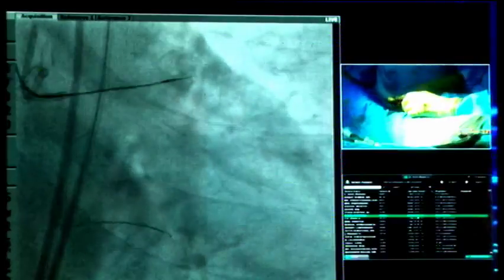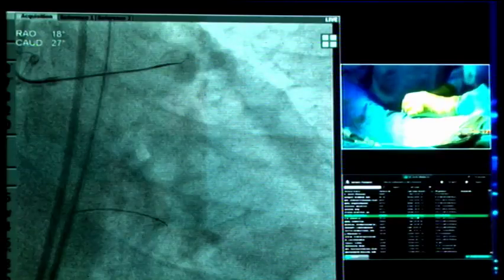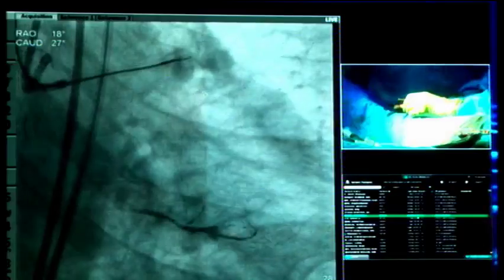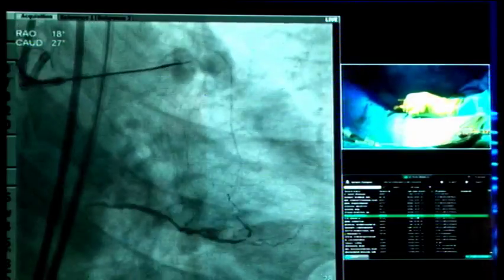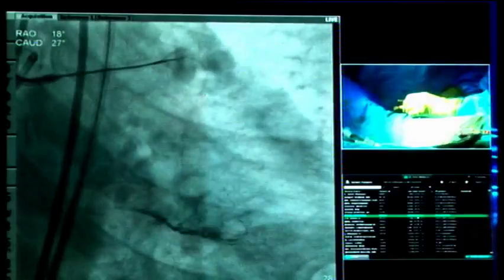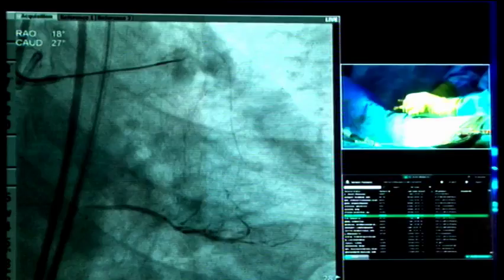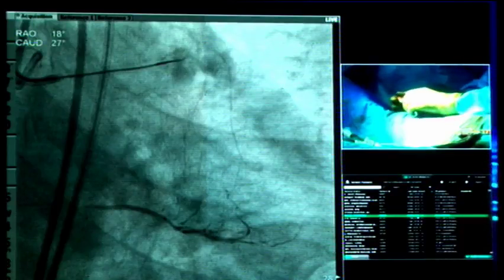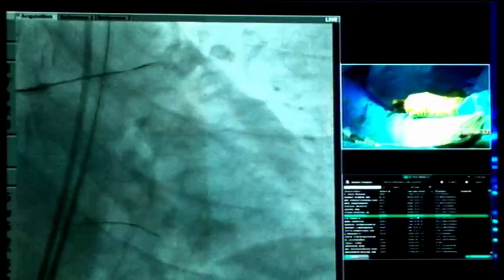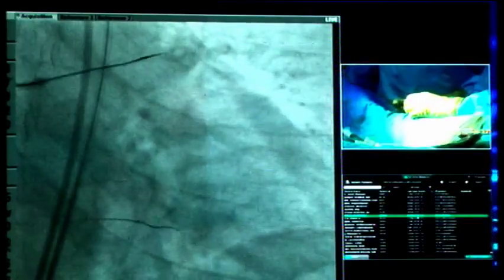Move the table slightly. No. Could you replay the previous one and make it a reference? Because sometimes we need a very good roadmap. Yeah. Stop. One by one, I'll tell you when to stop. Stop. Stop. Come back. Yep. Yeah, that is fine. Thank you. Very nice. Just slightly move the table, please. Just like that. Thank you.